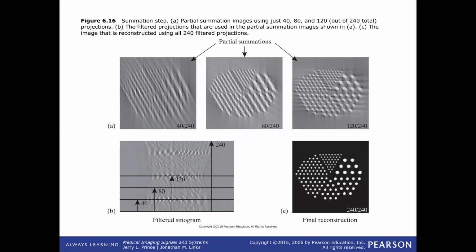And all of that came from the realization that the data that we have are radial lines through Fourier space, right? So when you just back project that data, you basically overweight the DC components. You're oversampled at the center of the Fourier space, and that gets compensated for by this ramp filter, right?